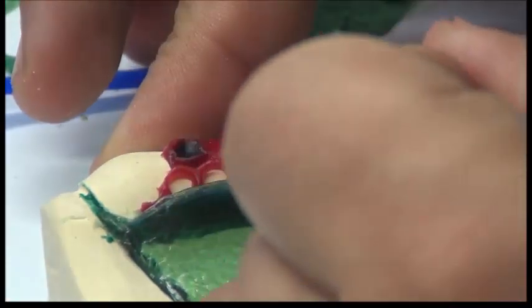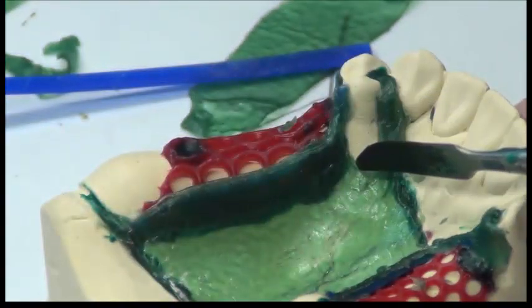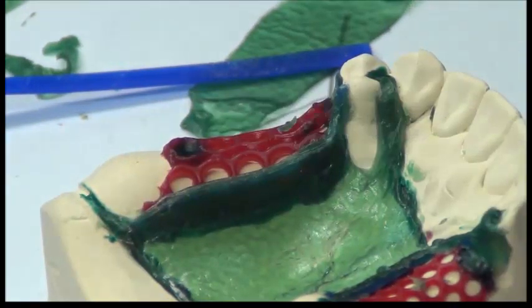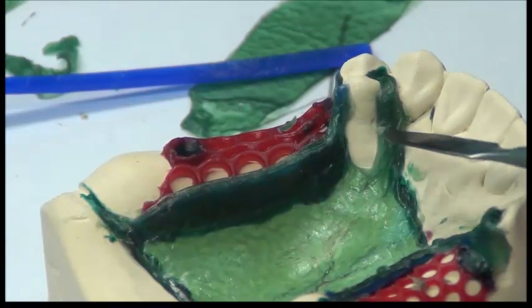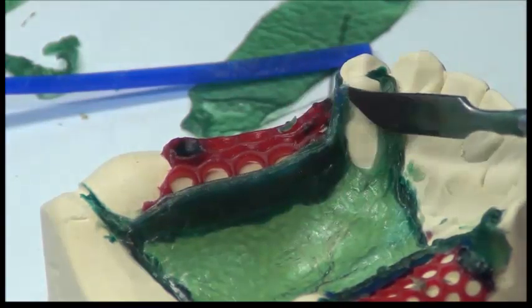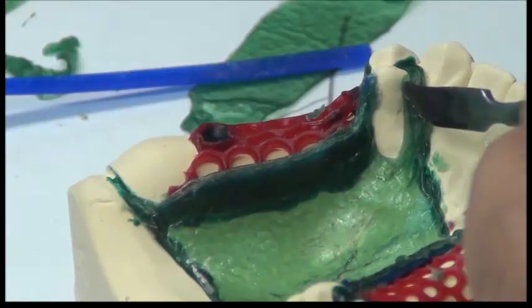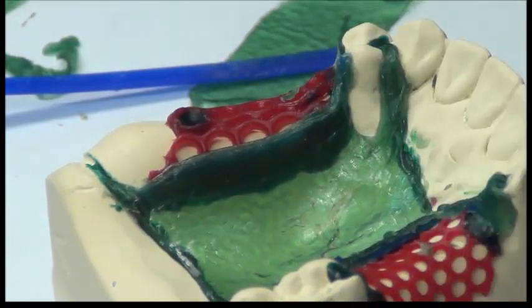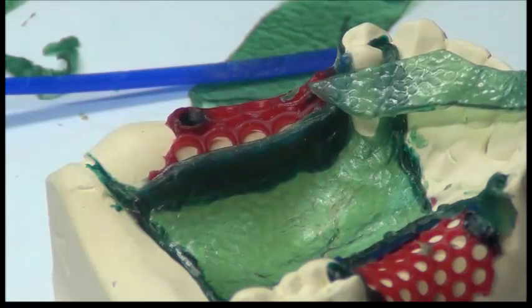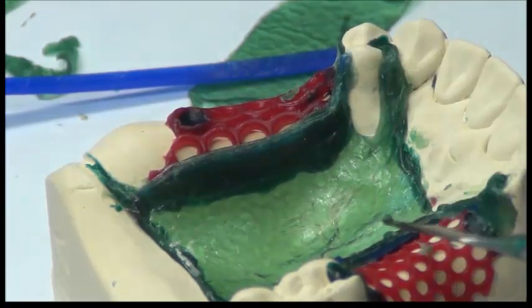I could run down in an arch form, exposing how many millimeters? 6 millimeters in the upper. So I exposed this vertically by 6 millimeters, and horizontally, the two vertical components have more than 5 millimeters separating them. This is more hygienic to this tooth. Okay? If this tooth doesn't need the support and periodontally is sound and everything is okay, then no periodontal disease, no problem with the bone support, I could separate the two components from each other. So we have the two options, either a plate, okay, reaching the survey line on the abutment teeth, or the clearance way where we are exposing 6 millimeters and vertically connecting it. Now adding in the major connector for the lower is a bit more complicated.